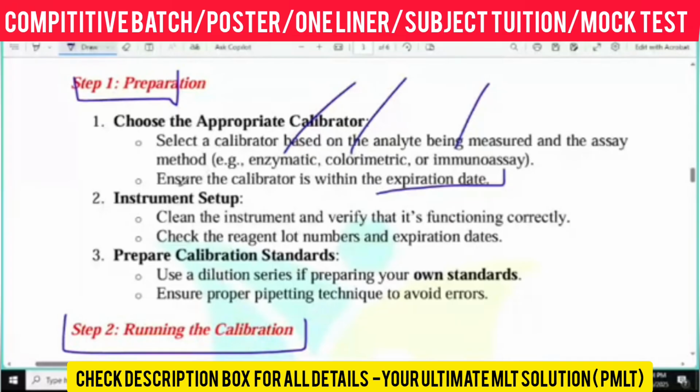Understood? Secondly, instrument setup. You have to clean the instrument properly and check that it is functioning properly. You have to check how much reagent is already present in the instrument, how the control is running, and the reagent expiration date.